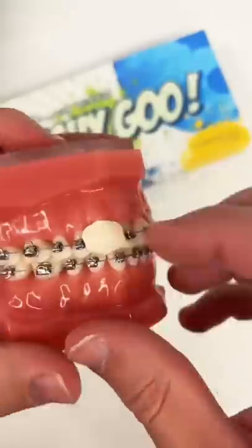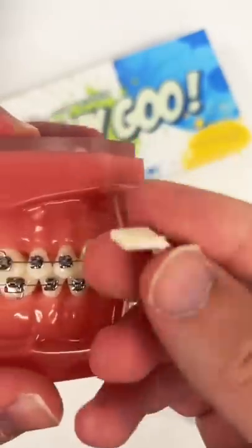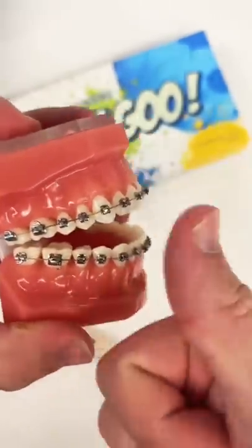After about 30 seconds, gishigoo is super hard and will not come off with any picking, eating, or anything. Of course, when you're done with it, just peel it off and remove it with no harm done. So ditch the wax and get something that actually works.